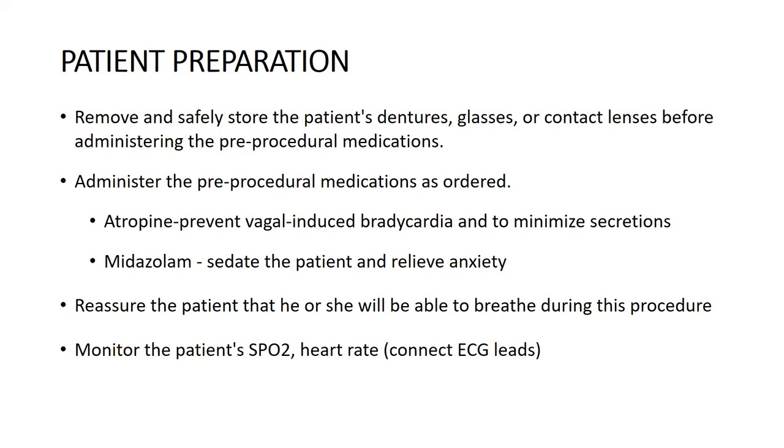The patient's dentures, glasses, or contact lenses should be removed and safely stored before administration of pre-procedural medications like atropine, to minimize secretions and also to prevent vagal-induced bradycardia. Midazolam is also used to relieve the patient's anxiety and to sedate the patient. Reassurance should be given so that he is able to breathe during the procedure. The patient's saturation and pulse rate should be carefully monitored, and cardiac activity should be monitored by connecting ECG leads.